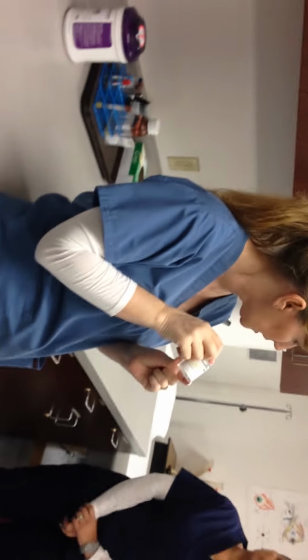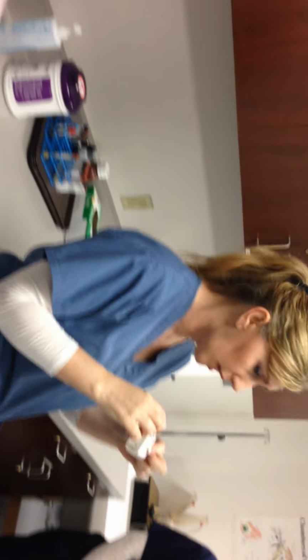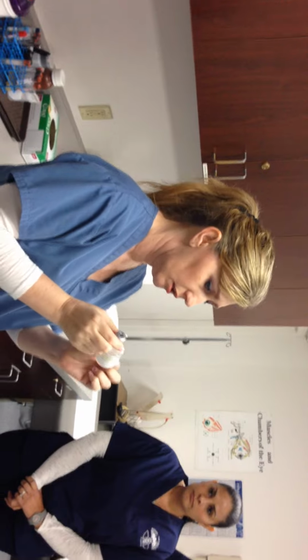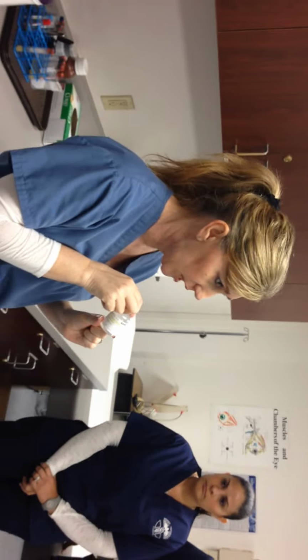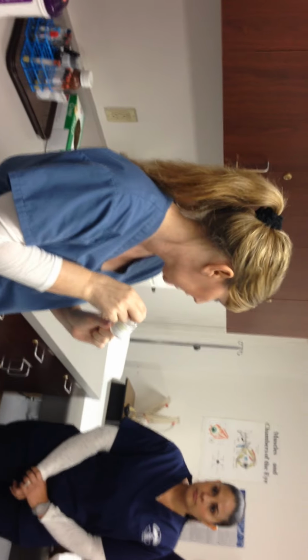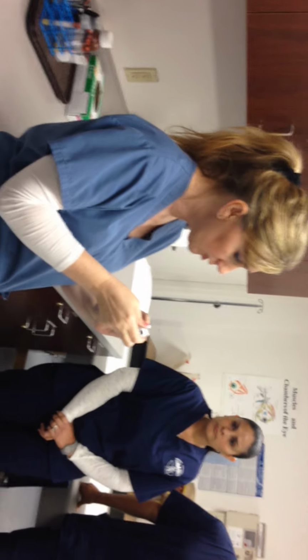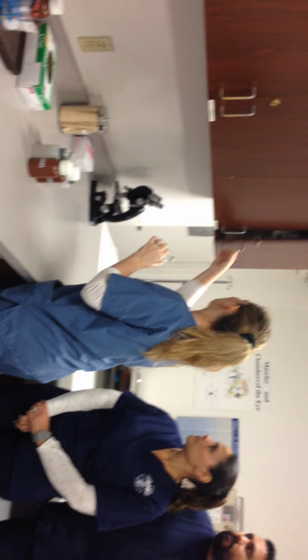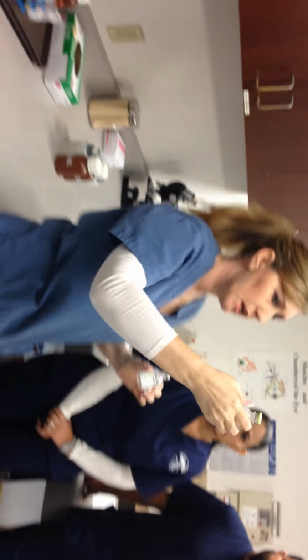So when you guys are documenting in the chart, you're writing down, okay, blah, blah medication, such and such milligram strength, the lot number. You're also looking at the expiration date. When does it expire? Okay, so you want to make sure you're not giving expired medication. Now, the other thing you have to do is when you open a brand new vial, okay, you're going to write on there the date of when you open it. See, this one's not open yet, okay?